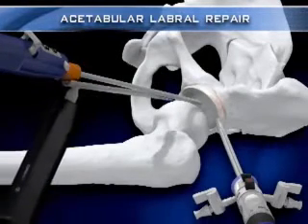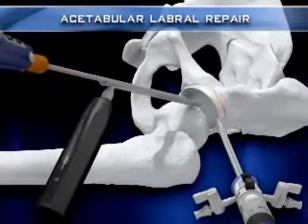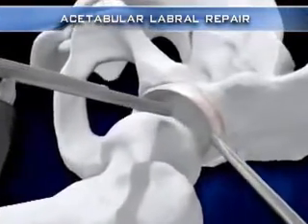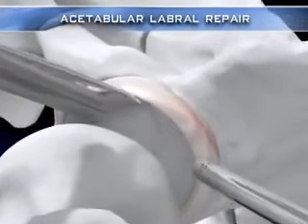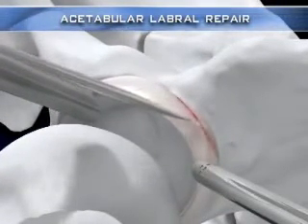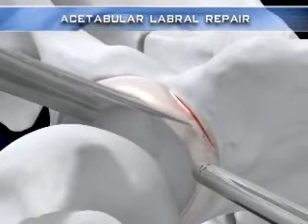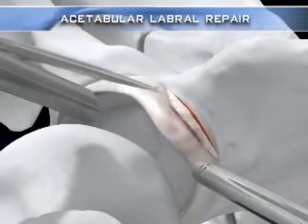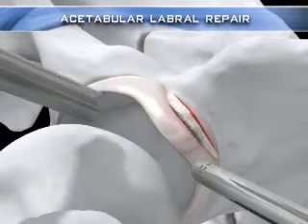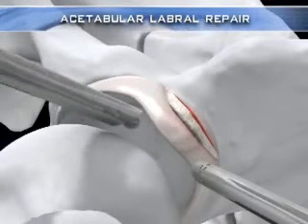The open cannula is used to quickly switch from a shaver to a banana blade, required to take down the labrum from the acetabulum. Once the underlying acetabular rim is exposed, a burr is introduced into the joint to remove the bony deformity.